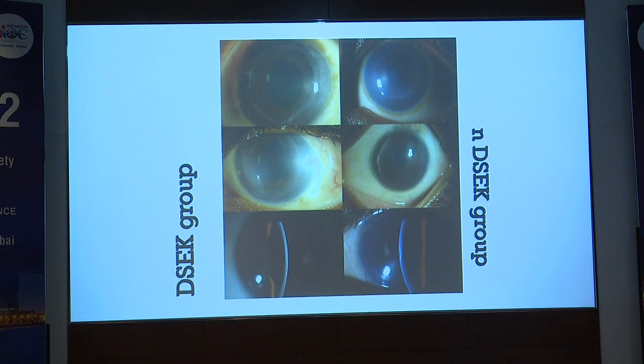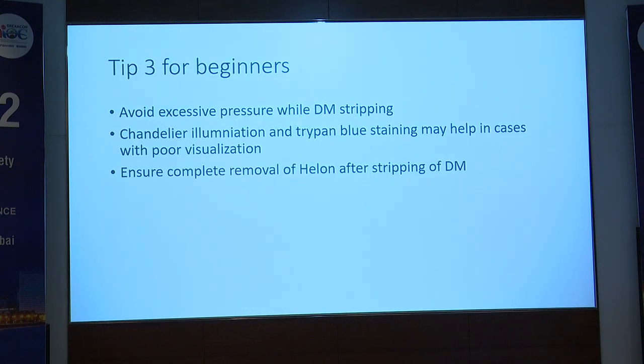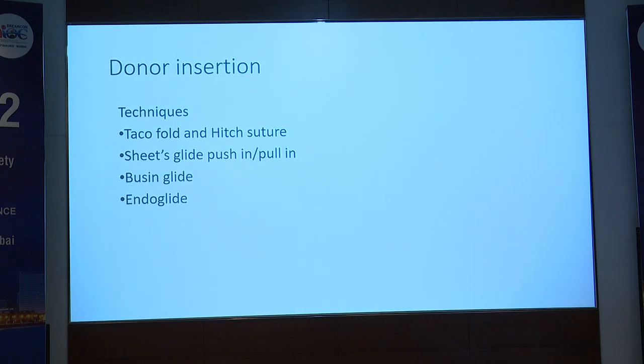Again, if the Descemet is not diseased, like it's not a case of Fuchs dystrophy, you can just do a non-Descemet stripping endothelial keratoplasty and it gives equally good results, and there is no increased haze in the interface whether you score or don't score the Descemet membrane. Again, for beginners, they can use Healon in the anterior chamber so that it's easier for them to strip the Descemet membrane, and ensure a complete removal of your Healon after stripping the Descemet membrane.